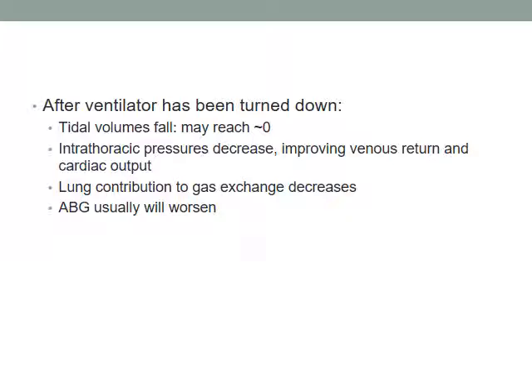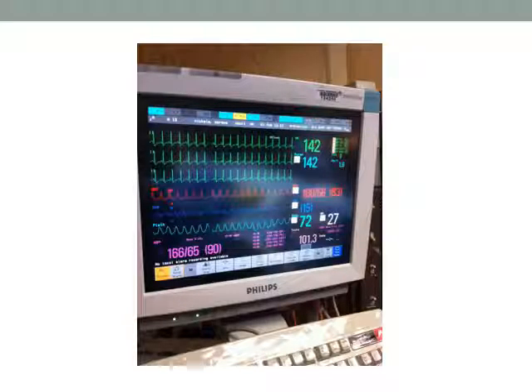And often, as we mentioned, because we don't capture all of the blood that goes to the ECMO circuit, we have a mixing of blood that is the patient's central venous blood mixing with ECMO blood. The end result is sats will not be 100. They may be in the 80s. Sometimes they may be in the 70s. Nobody here wants to have low sats. But we don't want to destroy the lungs any further. We are willing to accept low sats in these patients. We typically don't get worried about sats over 80.